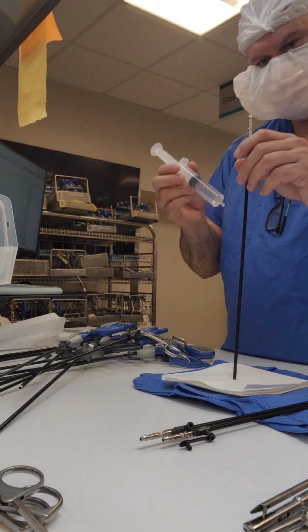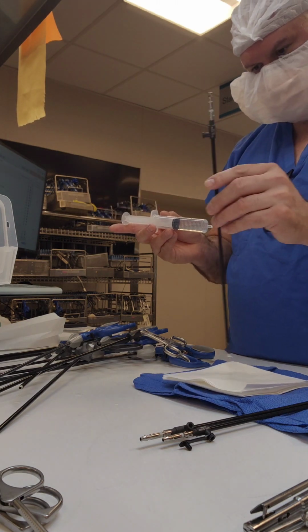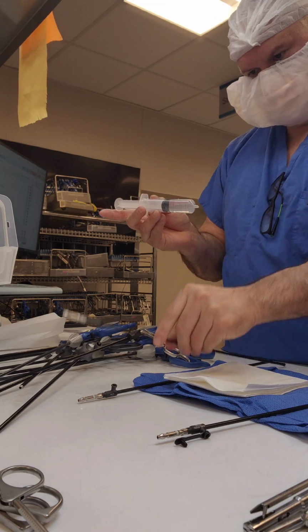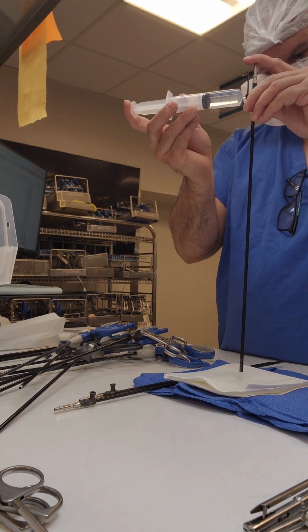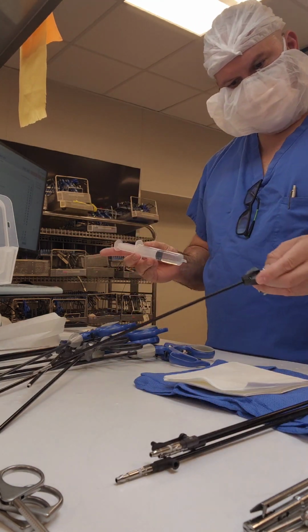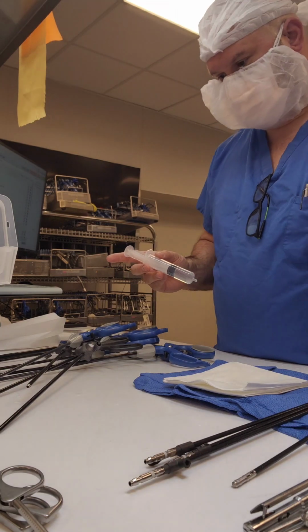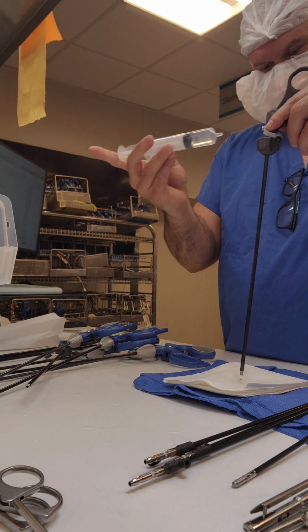tell if that's dirty. The purpose of flushing is to see if you get any blood or bioburden out of there, and making sure that you're getting all that water out of there. Now, many of you will look at this video and go, well, Jesse, you're not drying your instruments completely. And again, I have my opinion on that. I don't use air at the table. I'm opposed to using instrument air at the table due to aerosolization. I think it's more of a risk than it is a benefit. But again, that's my opinion.